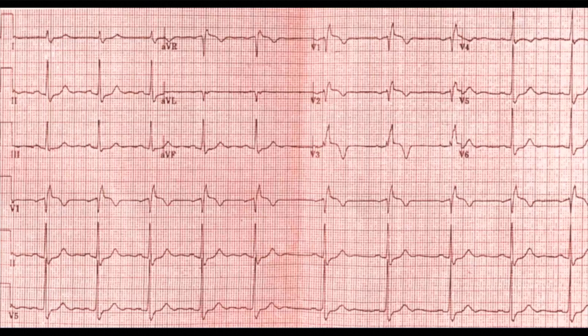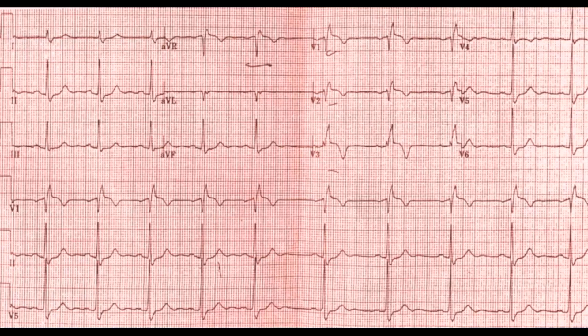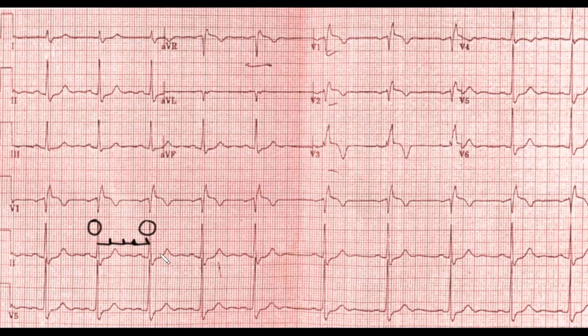Let's go through our evaluation using our five-step process. The first thing we want to look at is rate. We can pick the easiest place to look at, which is the QRS complex. We can see here clearly that we've got one box, two boxes, three boxes, and then four, and maybe a little bit extra.